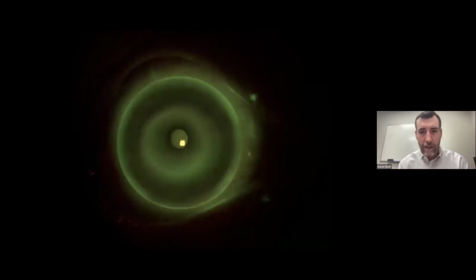What you're seeing now is a fluorescein video of that same fit on the same eye. And again, you can see that the centration is excellent without the lid propping the lens in position. Again, you can see that there is some movement there. You can assess fluorescein in your mid-periphery reservoir, as well as your edge lift. You can also assess if it looks like there's any bearing in that central cornea. Both are important to examine.